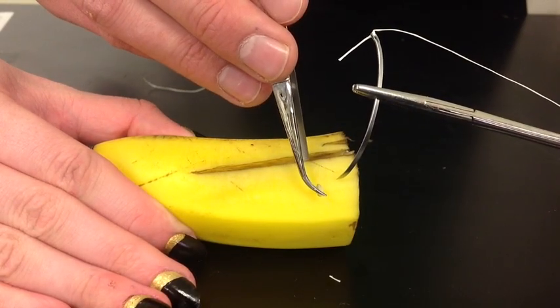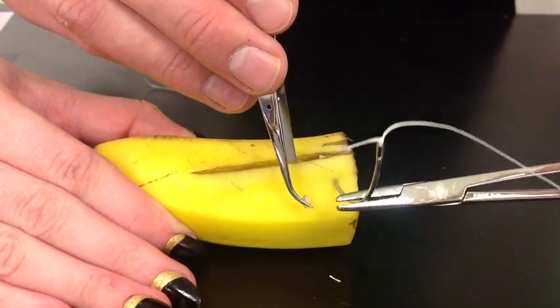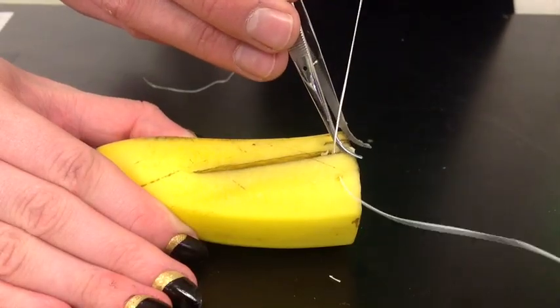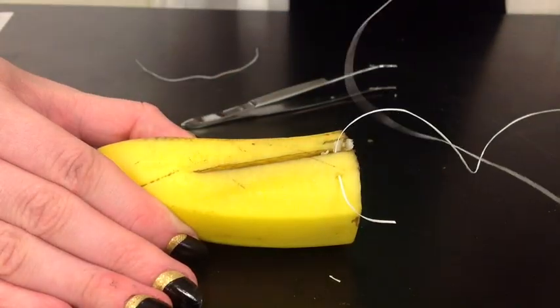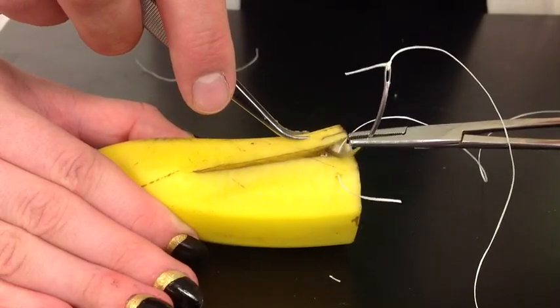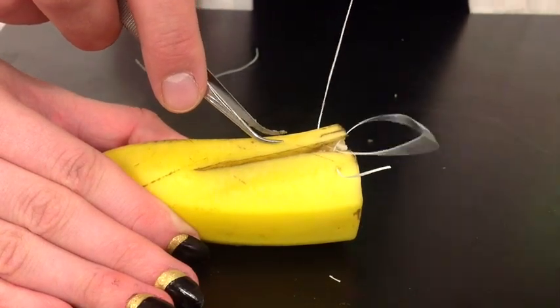What I'm going to do is go in about half an inch from the edge. I'm going to go straight in — notice here how I'm straight up and down at a 90-degree angle. I'm going to go all the way under the skin and come up through the wound. I'm going to pull this all the way through and leave it just a couple inches. Then I'm going to reattach my needle holder to my needle, go back into the wound and come out on the opposite side, same distance away. Pull it all the way through.